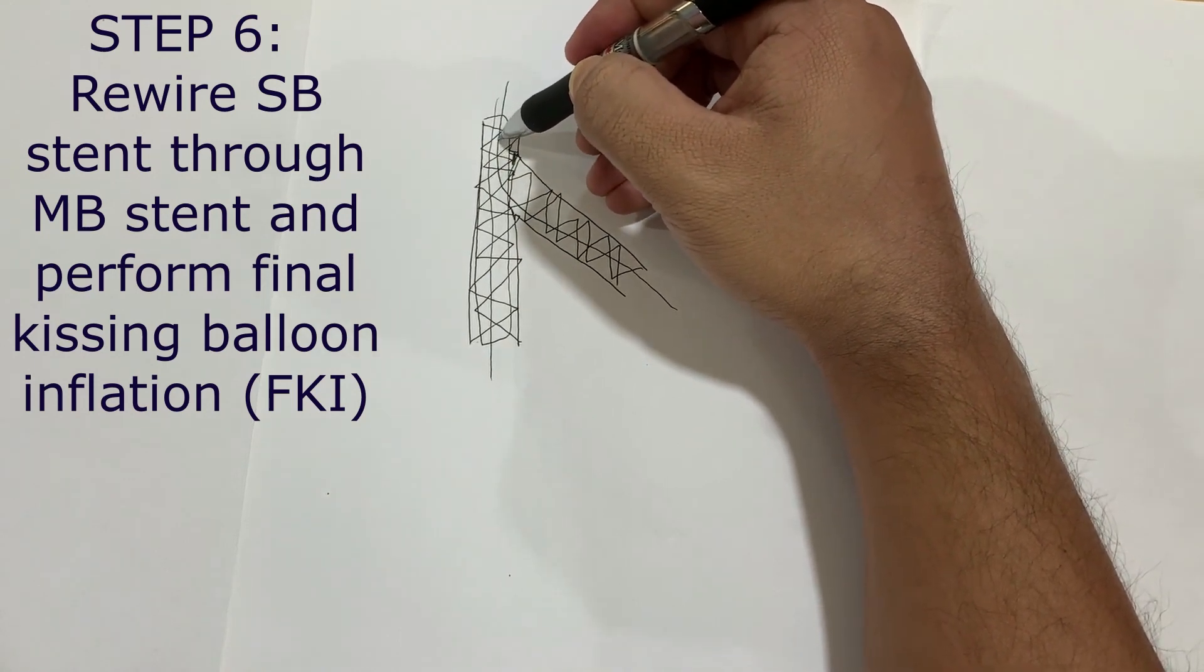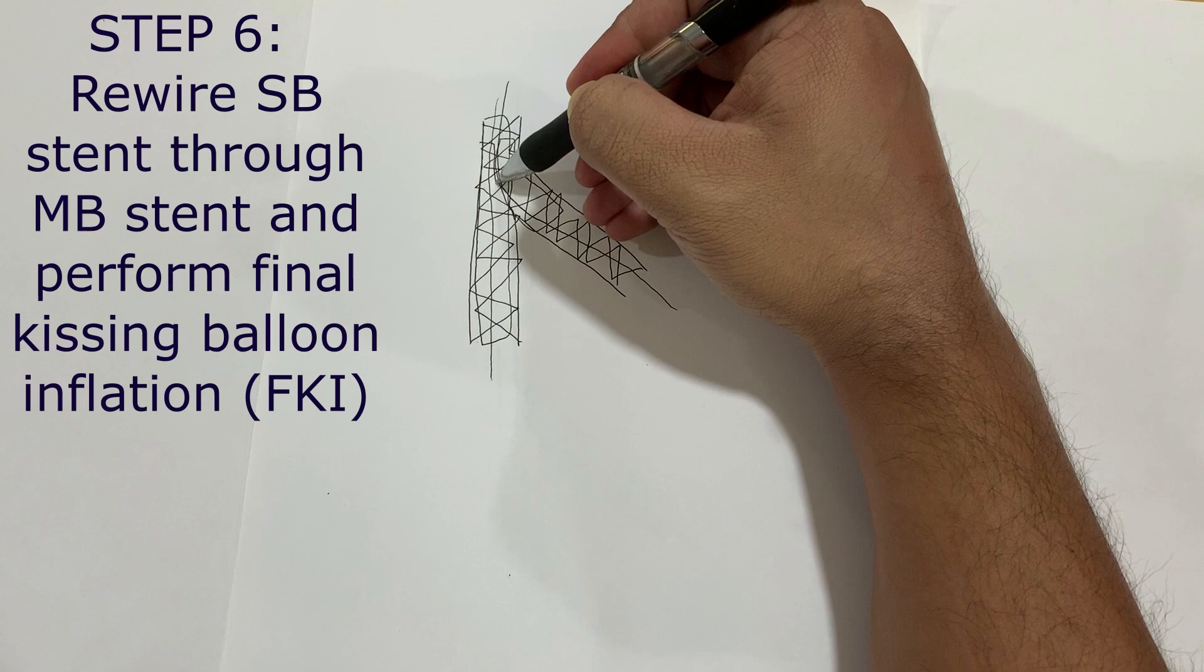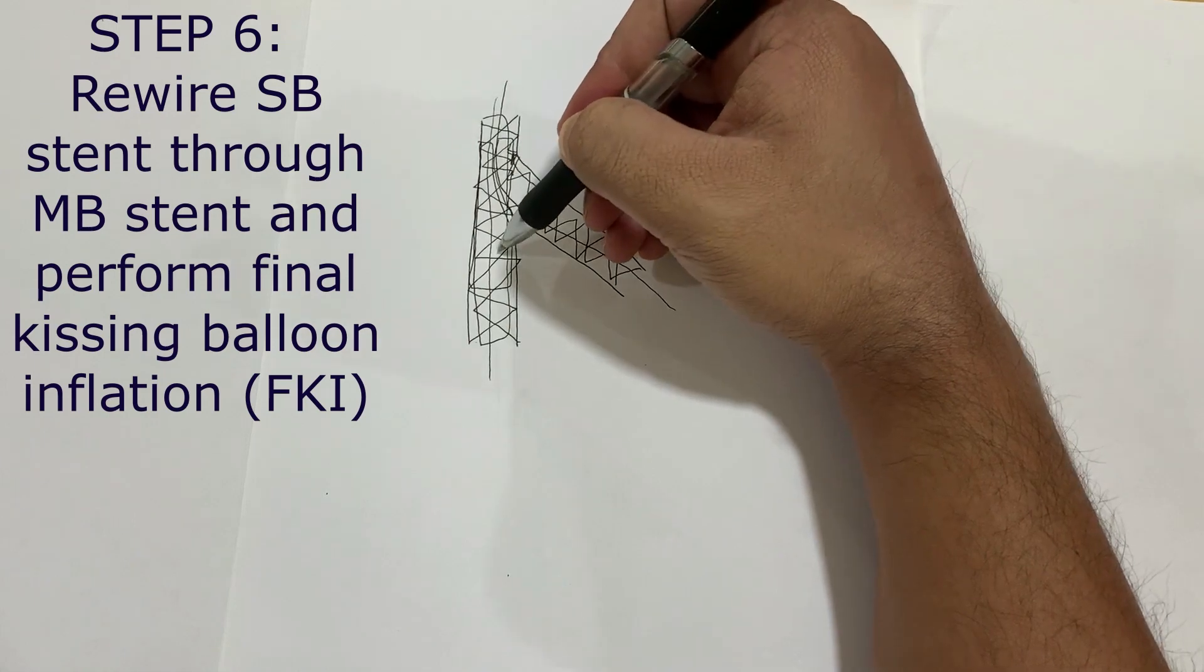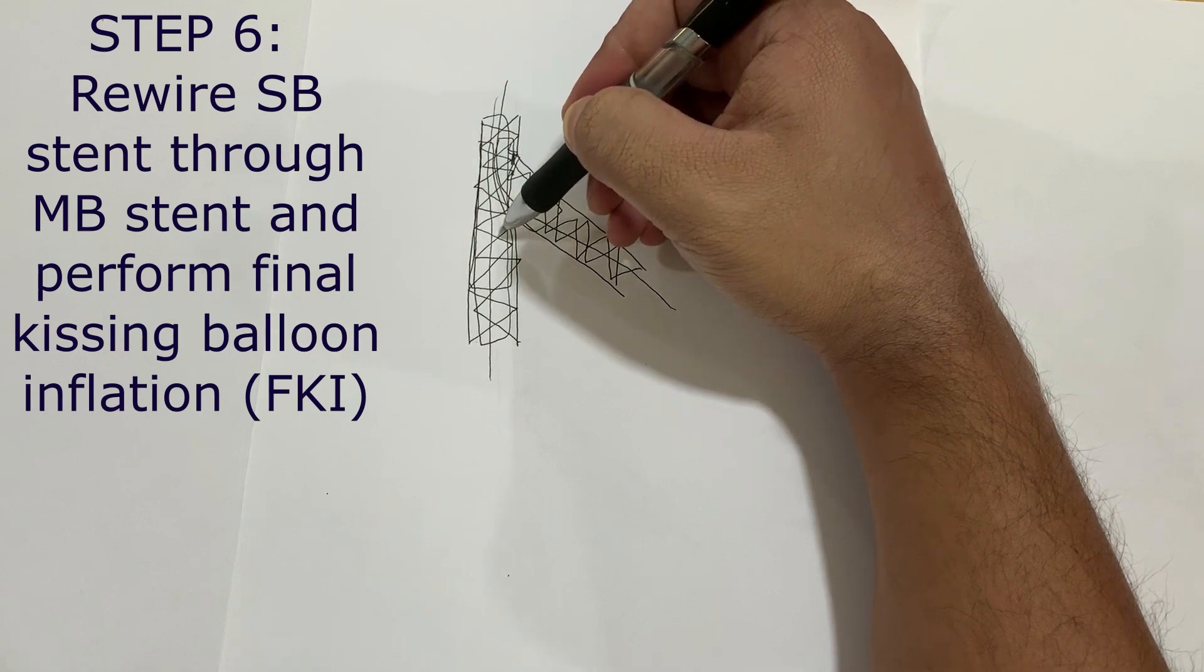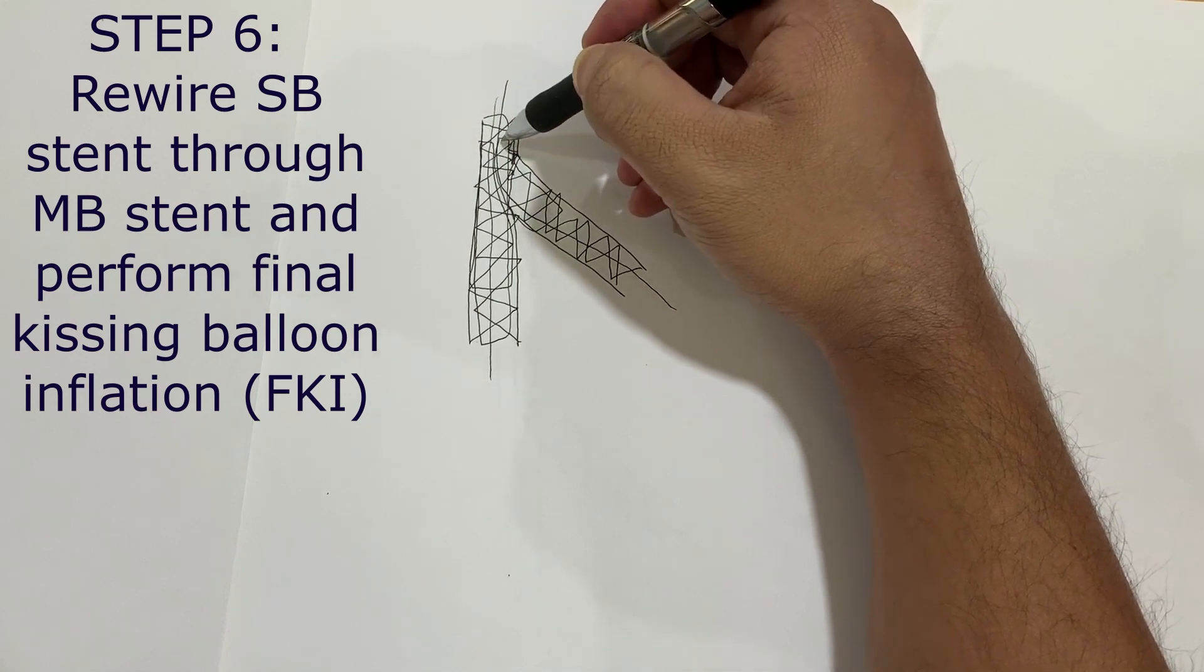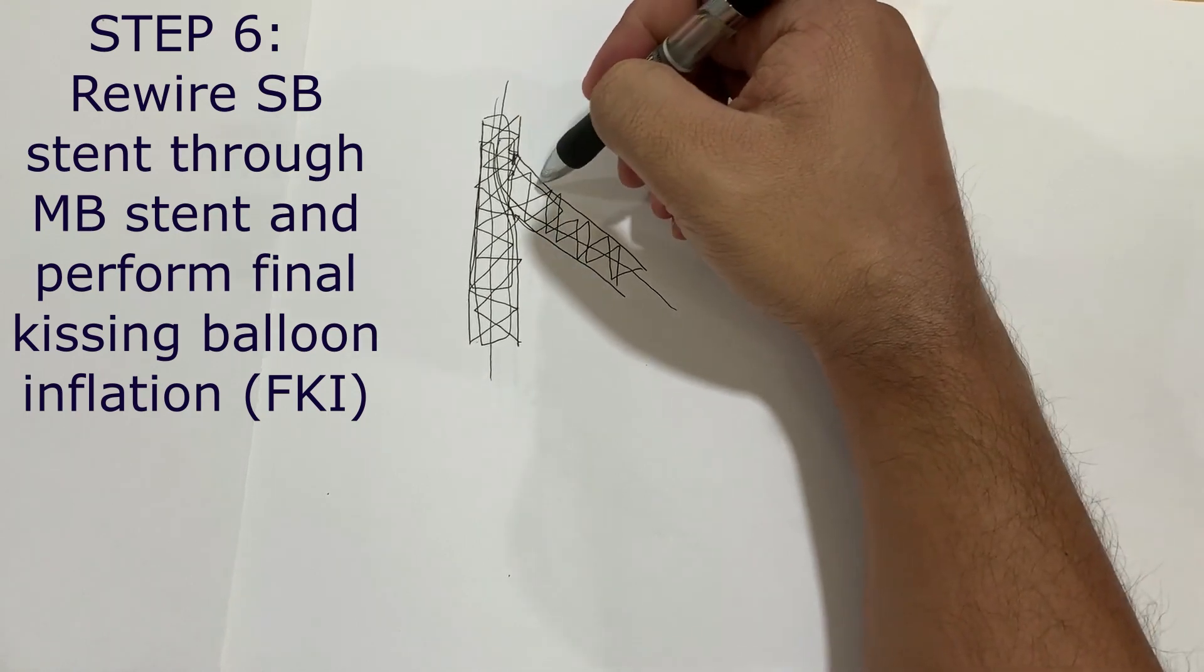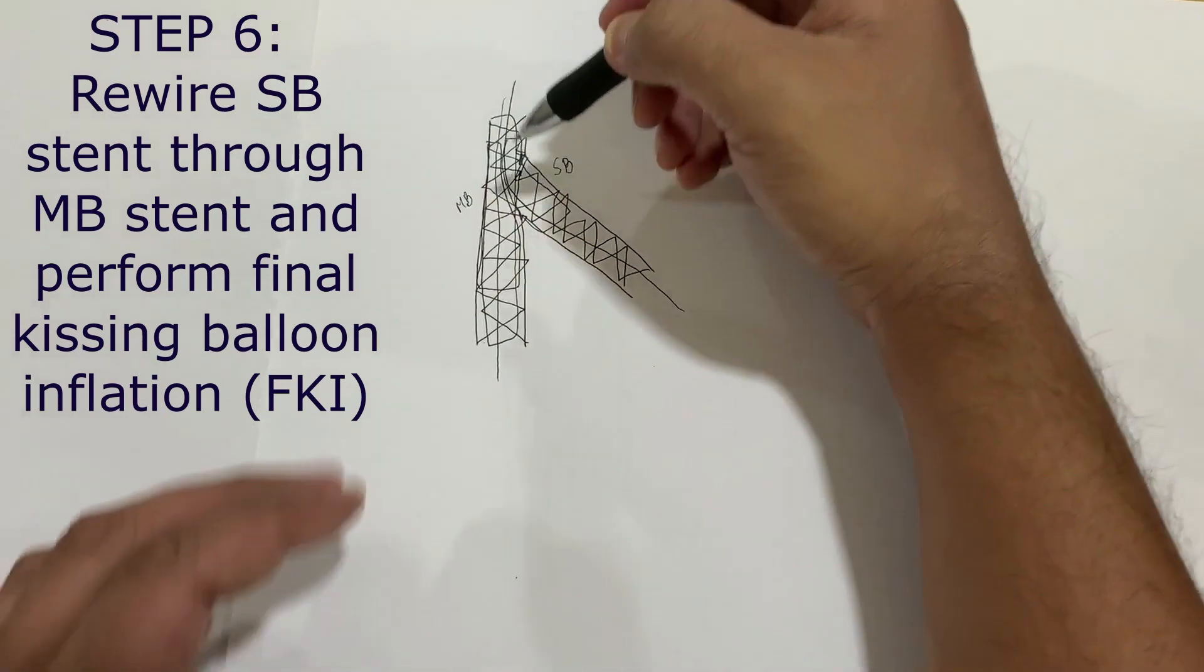Once you are through the distal strut, you can bring balloons on these wires, preferably NC balloons, but sometimes it's difficult to get the NC balloons so you can always choose a non-NC and an NC balloon on one of the wires. What I tend to do is that I inflate the side branch stent first, or the balloon first, and then I do the main branch after that, and then finally I do a final kissing balloon stenting inflation.